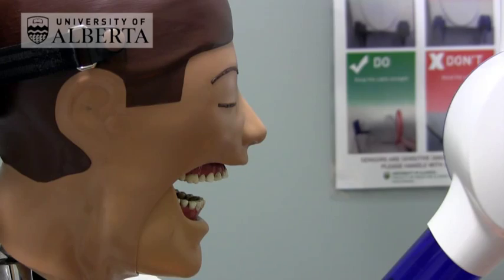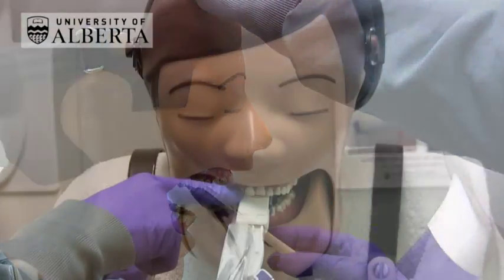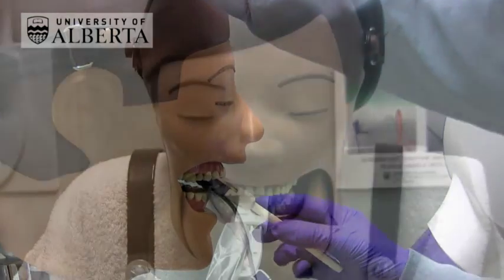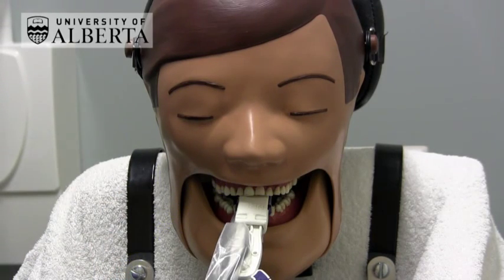Place the anterior periapical sensor like this and get the patient to close together onto the groove in the bite block. The challenge with this technique is that there is no aiming ring to help you decide on the right angulation of the BID.